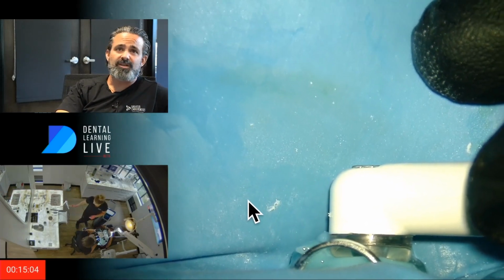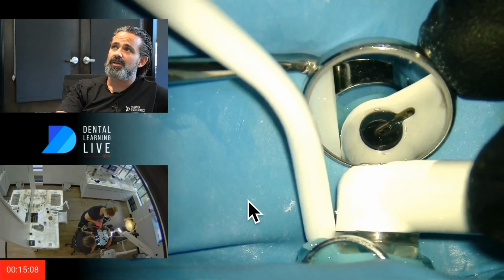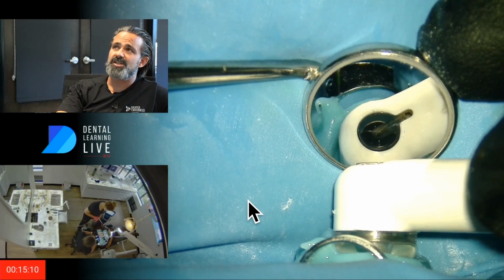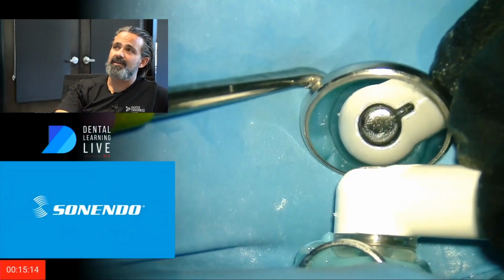And it's going to go through the degassing phase. I mean, the procedural instrument, although it looks different than the molar, it's the same. It's just that cavitation's happening in the head of the handpiece.